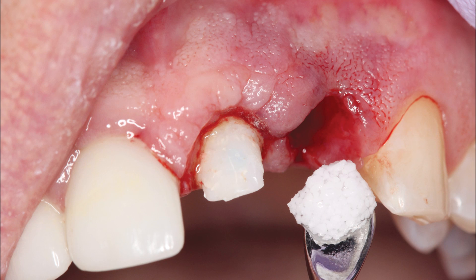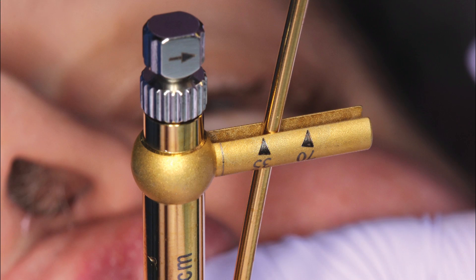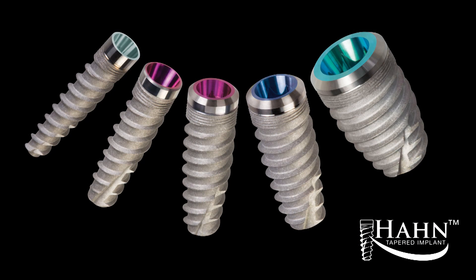Grafting material was placed at the extraction site. Serosorb M material from CuraSan was placed in the osteotomy site prior to implant placement. The 3.5 mm by 13 mm Hahn tapered implant was threaded into the osteotomy until fully seated and exhibited significant initial stability. Maximizing primary stability is crucial in implant therapy, particularly for immediate extraction and implantation. The tapered body of the implant is suitable for tight areas and sites where aesthetics are important, and its prominent buttress thread and widened apex help establish excellent stability in all bone types.